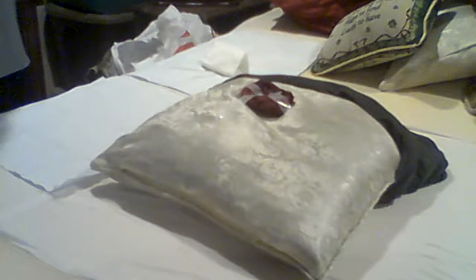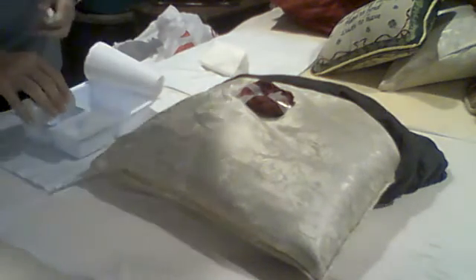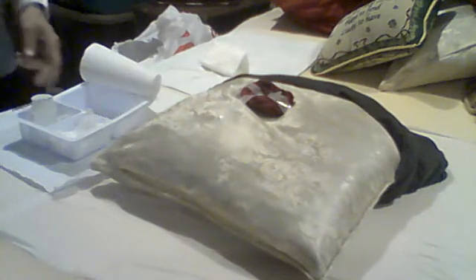I'm going to go ahead and open up my saline that I have right here. Pour a little bit out. Pour a little bit there. And then I'm going to go ahead and don my sterile gloves. When I don my sterile gloves, I'm going to use sterile technique.